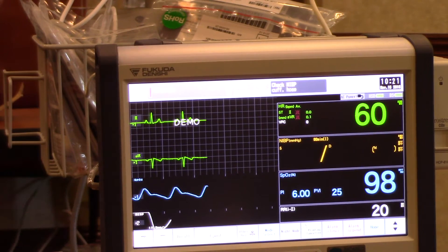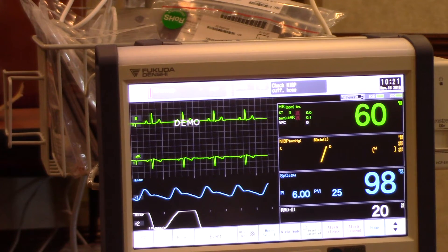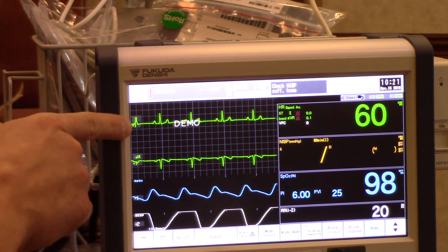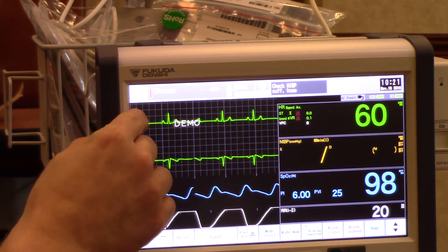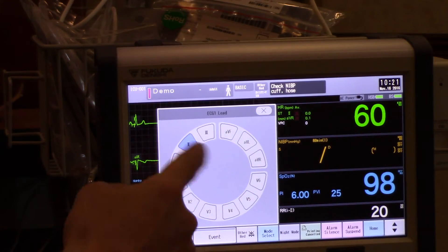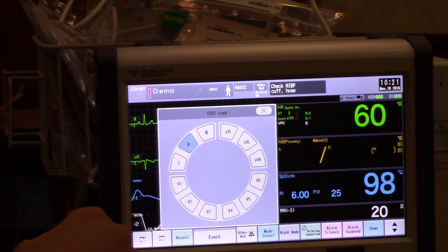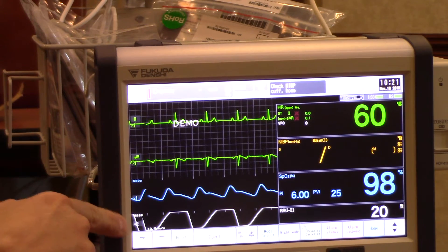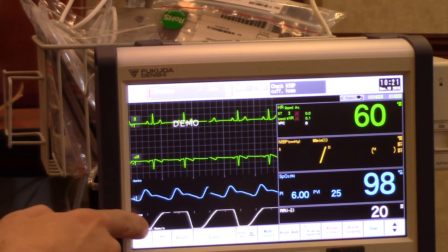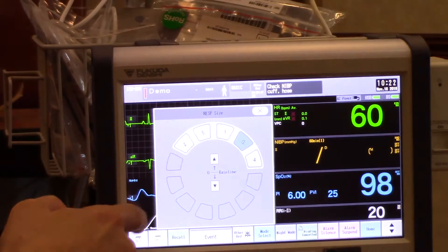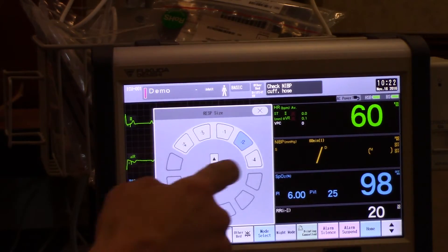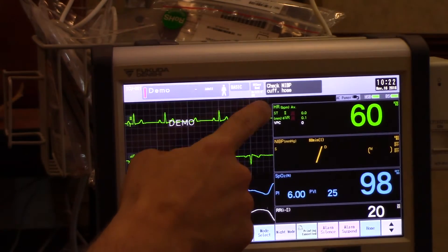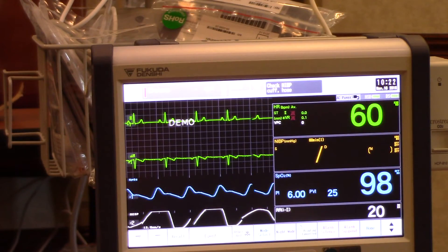Another direct path to change my leads or change the gain of my ECG waveform is to simply press on the screen where it has the Roman numeral II — that brings up my wheel of lead choices. Or for instance where it has times one or times two for respiratory; if I press on that screen I'm then able to make the waveform smaller or larger based on patient condition. And I can X out once I'm through.